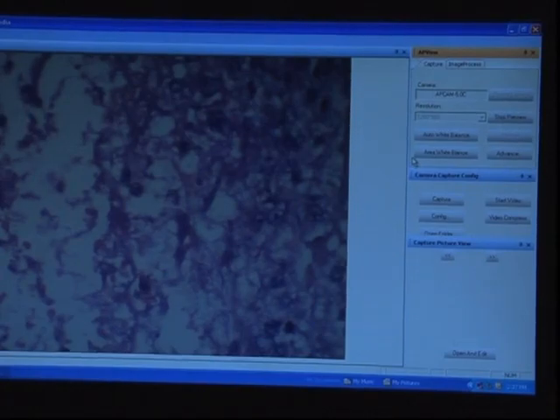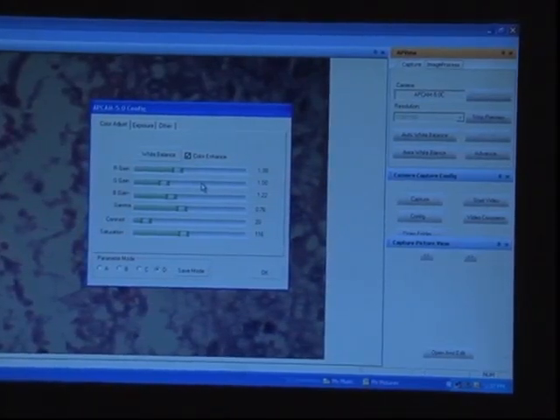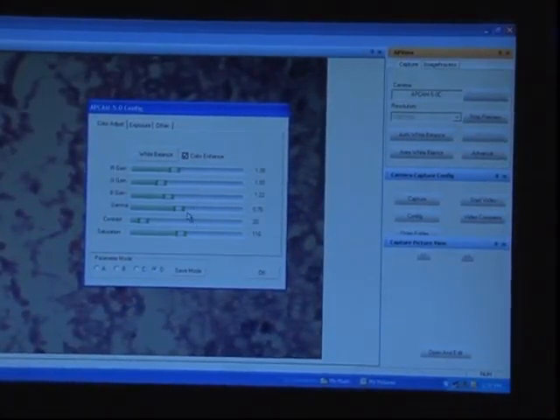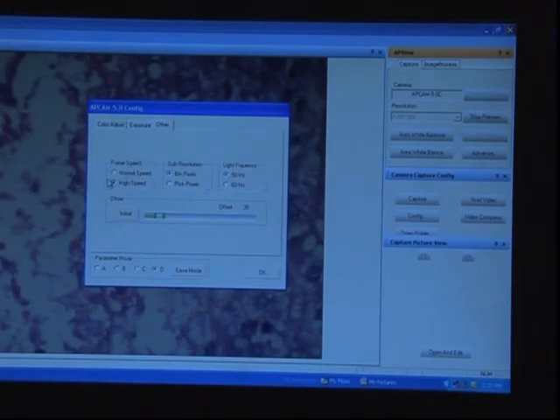Area white balance is similarly used. The advanced button is used for gain and color contrast selection. The default values should not be touched normally. If one wants to set values, the parameter mode should be changed, otherwise the default values will be lost. In the other options, it gives you a high speed and normal speed frame rate. Normally high speed is chosen and a bin pixel option is selected.